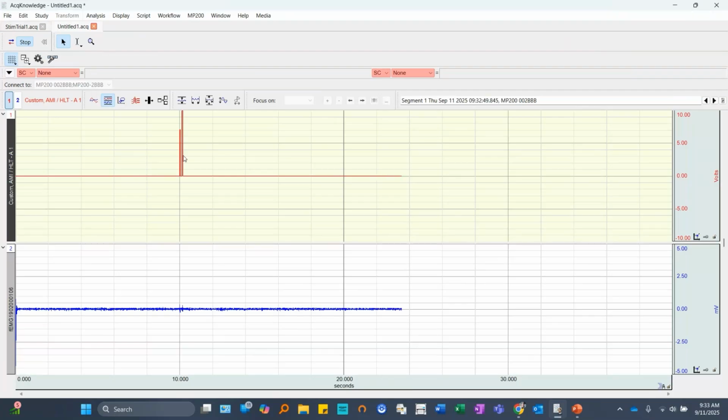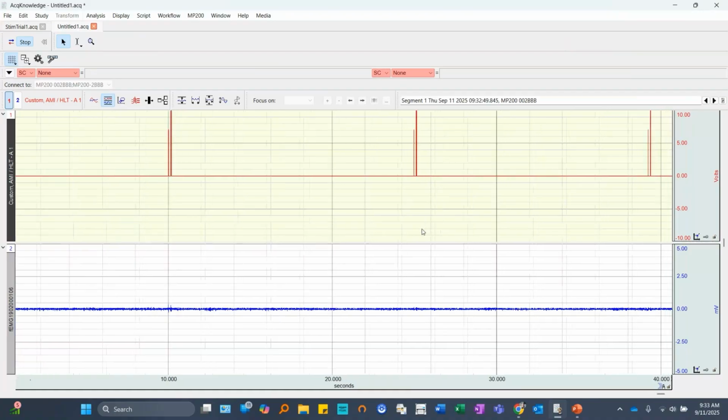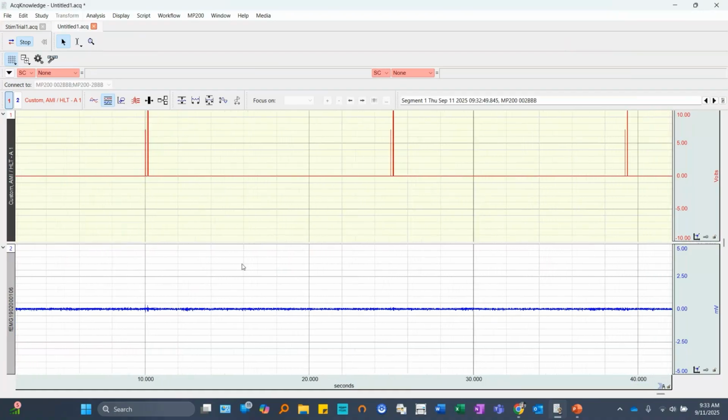And just like we created in our file, the first one started at 10 seconds. The second one hit around 25. And so now this is where we would just basically sit back, let the subject go through the entire trial. And once it's done, then disconnect them, and again, bring the next subject in and so on and so forth.